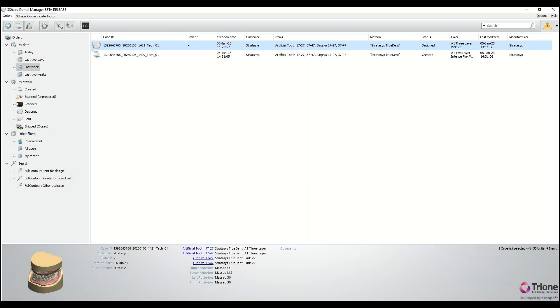With TrueDent materials, you can now print full color, monolithic, and highly aesthetic dentures. In this video tutorial, we will learn how to design TrueDent digital denture on 3Shape Dental System.